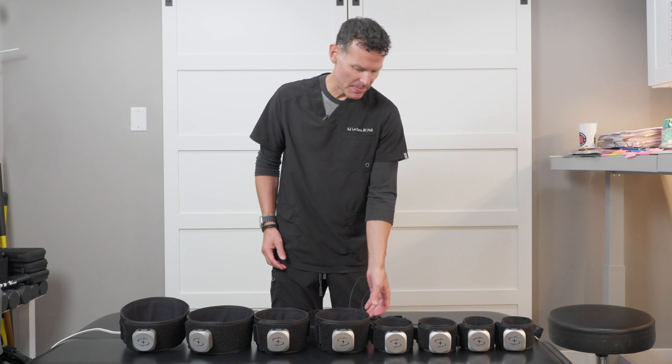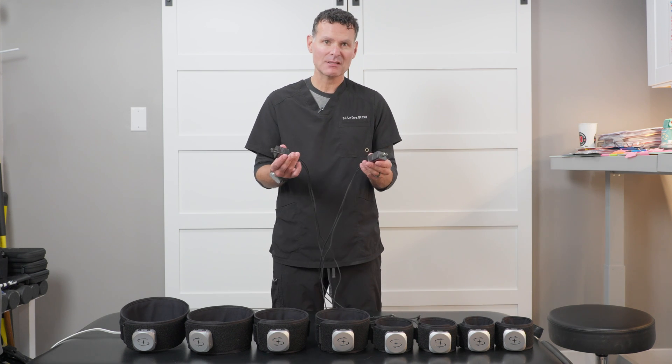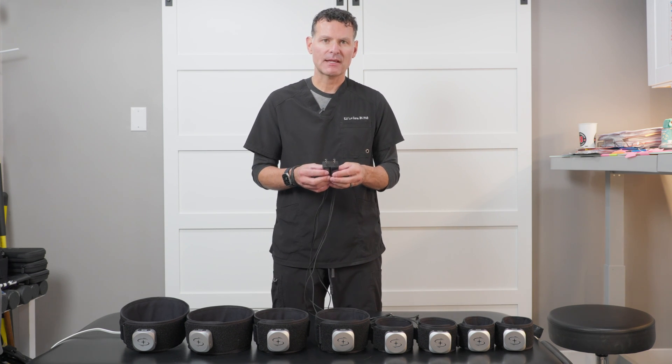This is what comes with it, plus charging devices where you can charge all of them at the same time.